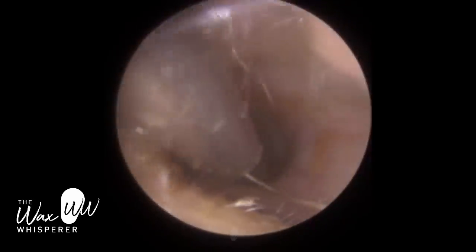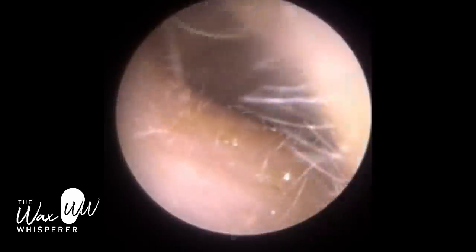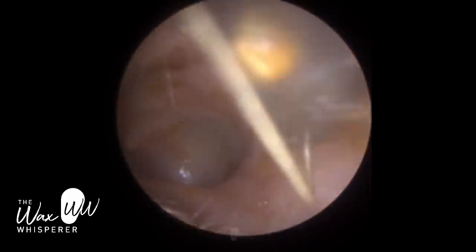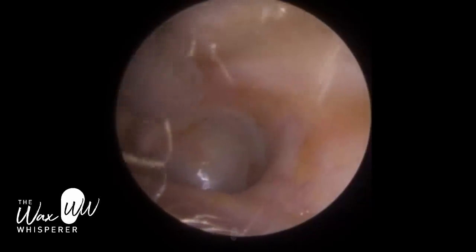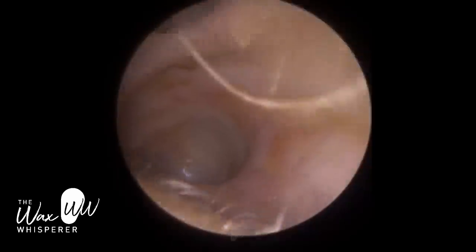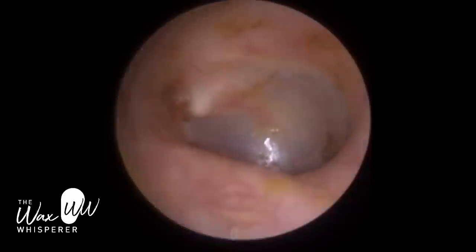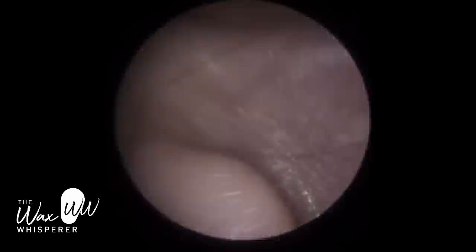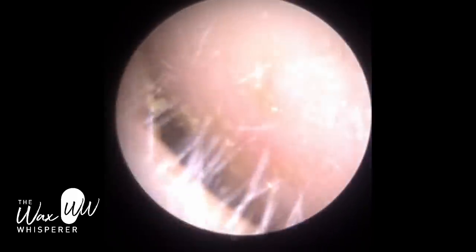The cartilaginous portion of the ear canal is semi-sensitive, so we can apply some pressure. It's made up of a thick layer of skin — 1 mm in thickness — some muscle, and then cartilage, which is malleable and flexible. The inner two-thirds of the ear canal have a very thin layer of skin measuring 0.1 mm or less, directly attached to bone with no buffering — no fatty tissue or muscle. So if you come in contact with the bony part, it's not a pleasant experience for the patient. There's a bit of staining and residual wax around the edge, but that's insignificant — we've got the main bulk out.